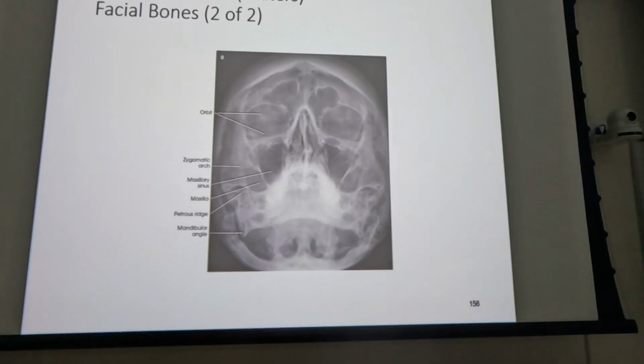There's just no way that you can make a diagnosis, so we're just going to throw ethmoid out the window. We can diagnose a sinus infection here, and what's the fourth set of sinuses? Sphenoid, right. If this patient were to open their mouth, you would see the sphenoid sinus through the open mouth.